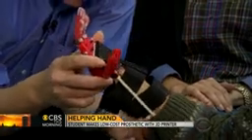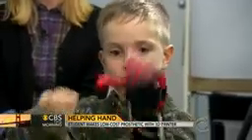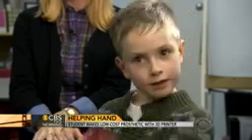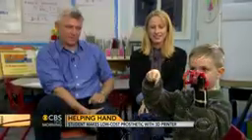Ask first grader Holden Mora how his new hand works, and he'll be happy to demonstrate. When I bend my hand in like this, it closes. When I bend it this, it opens. At 7 years old, he's become an expert on the workings of this novel device made out of plastic for roughly $20. It's an amazing $20. And normally the materials cost about like $1,000.